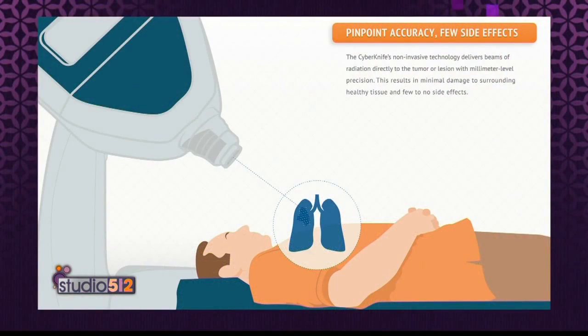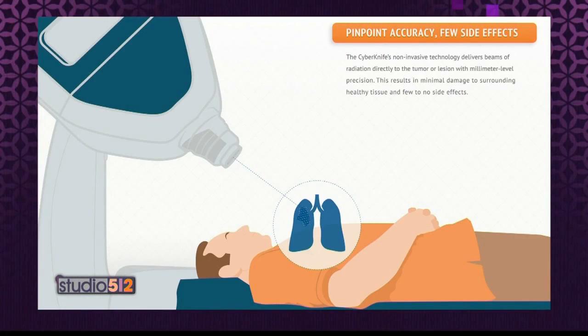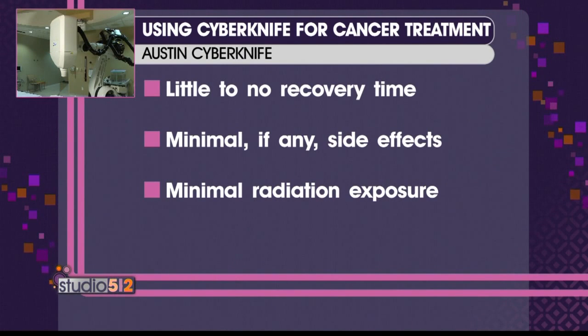What are some of the other benefits of this kind of treatment? Benefits, as I mentioned, non-invasive. It's less expensive than the old way. So for example, prostate, instead of coming in for 44 different daily treatments, we can do it in 5. And so even with the more sophisticated treatment and tumor tracking, it still comes out much more convenient and less costly.